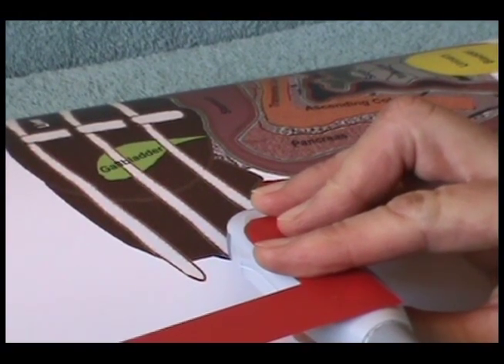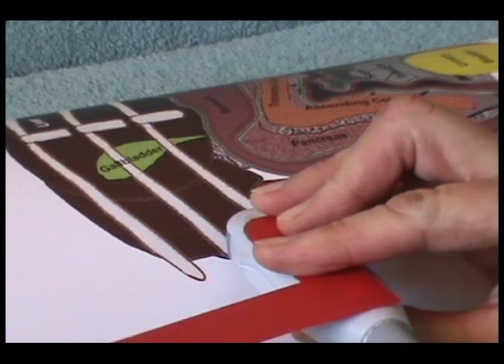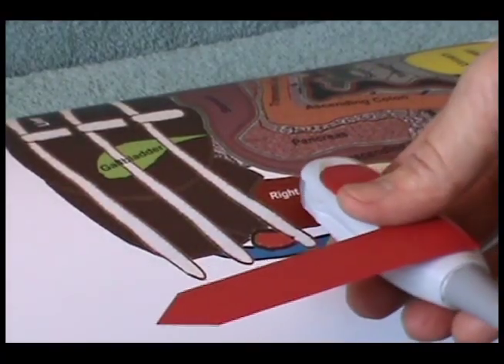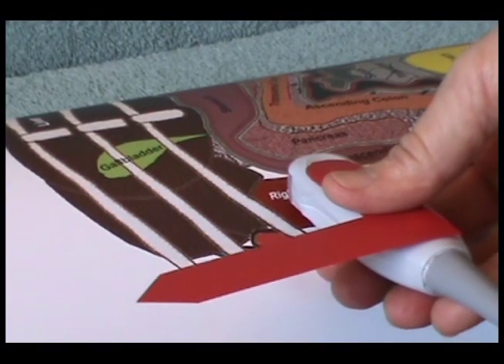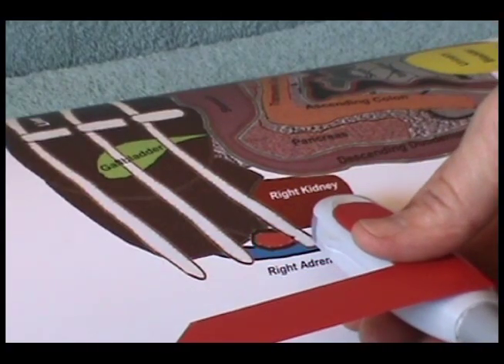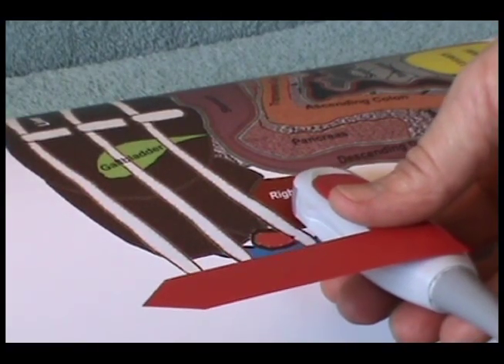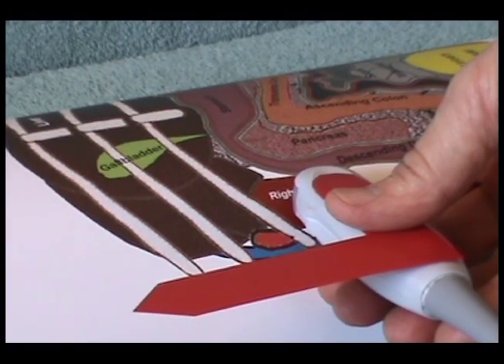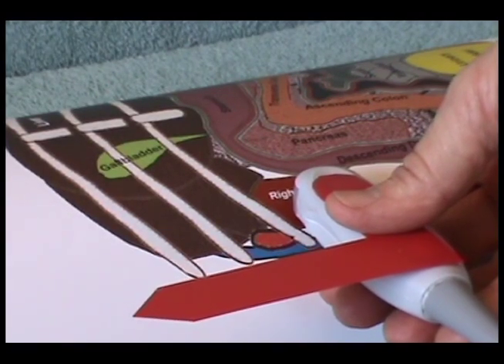You will be looking between the ribs, and rib shadows may partially block your view. To bisect the kidney, you may need to slide the transducer ventrally or dorsally till the transducer is centered over the kidney. The transducer should be perpendicular to the patient's body and parallel to the tabletop or floor.